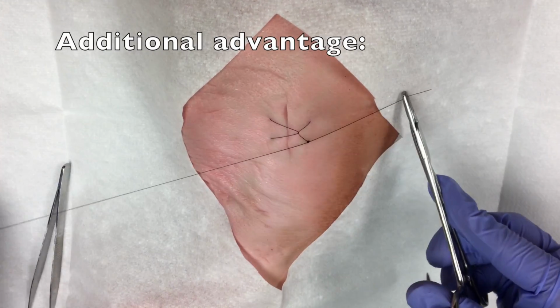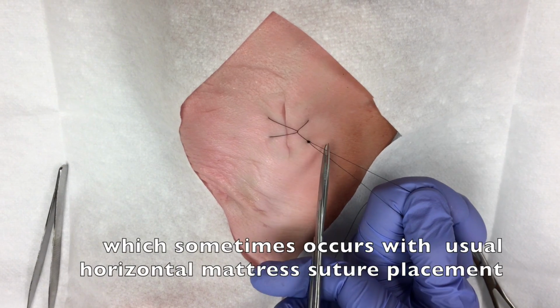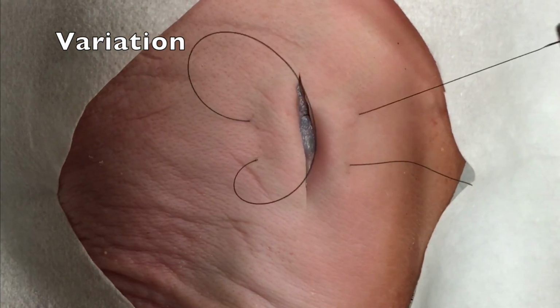The advantage of this method is that the suture material traversing the wound prevents any splaying of the wound, which can occur with a typical horizontal mattress. A variation of this technique can also be achieved.